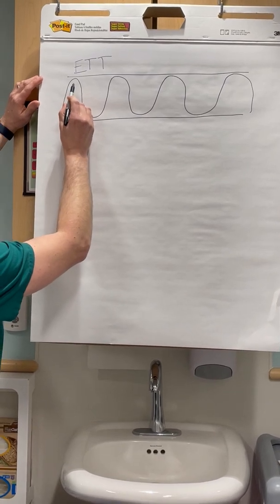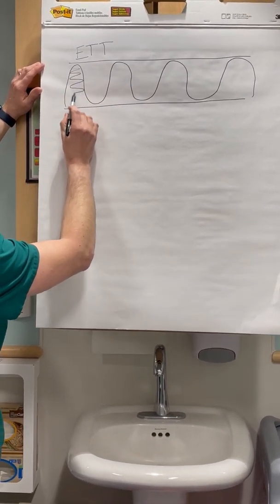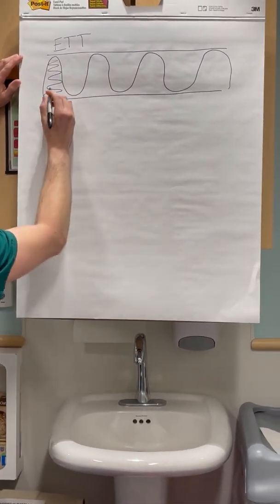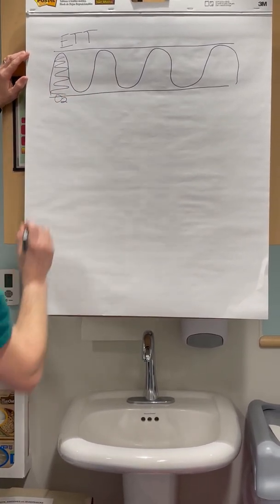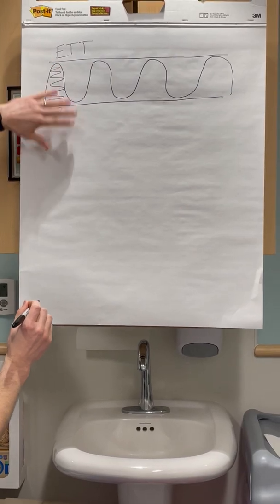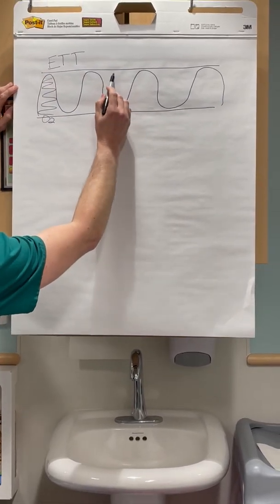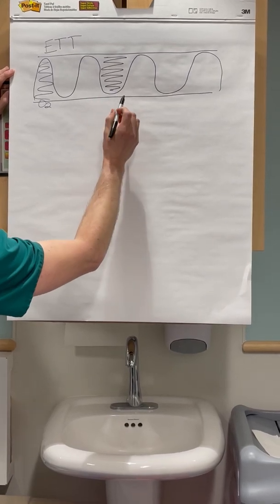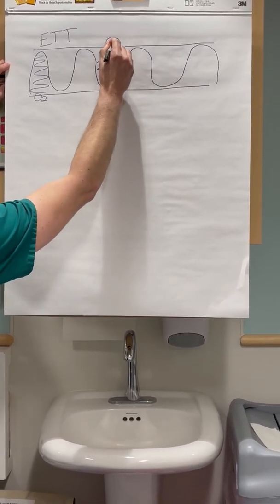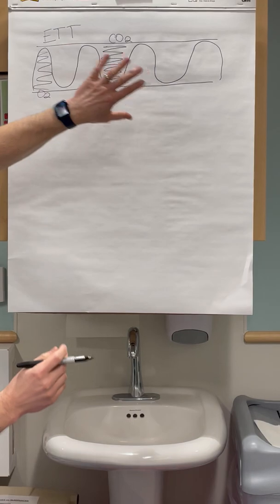So within these waves, we're going to say this is oxygen being delivered. And on the opposite side, this is CO2 being taken out of the baby.